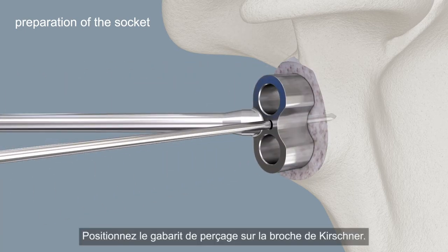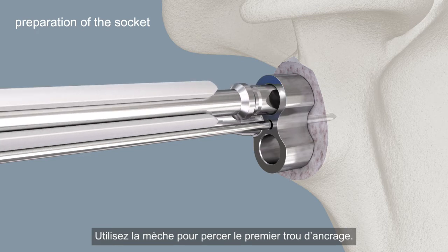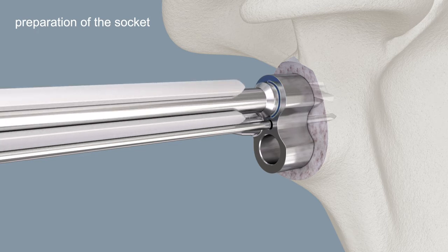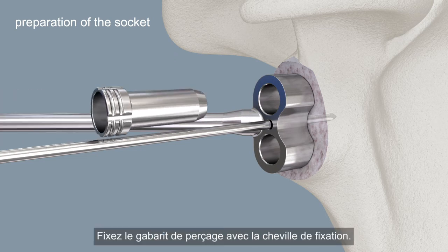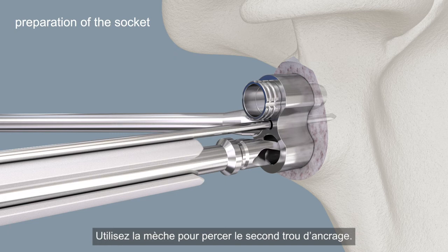Position the drill guide over the Kirschner wire. Use the drill bit to drill the first peg hole. Remove the drill bit. Fixate the drill guide with the fixation peg. Use the drill bit to drill the second peg hole.